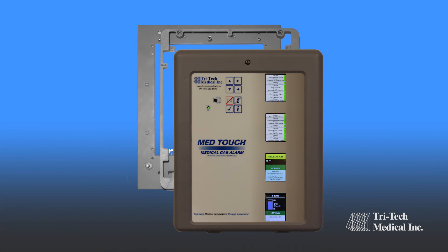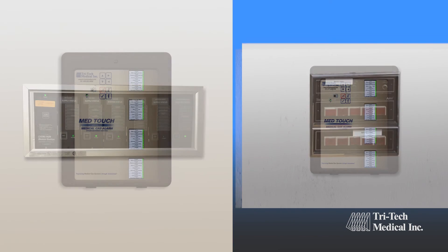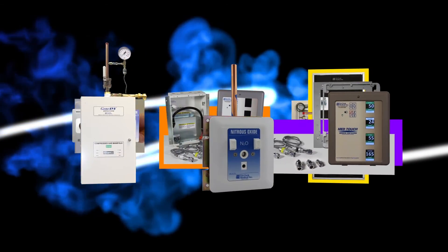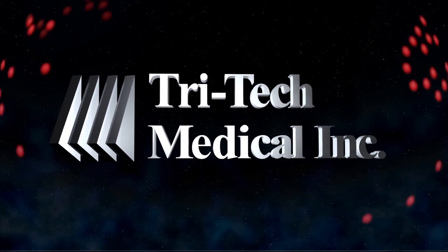With the Tritec Medical Master Alarm Retrofit Kit, most older master alarms may be upgraded with all of the newest technology options. It's clear Tritec Medical's family of innovative products will equip your facility for the dynamic needs of the healthcare industry. Tritec Medical, improving medical gas systems through innovation.